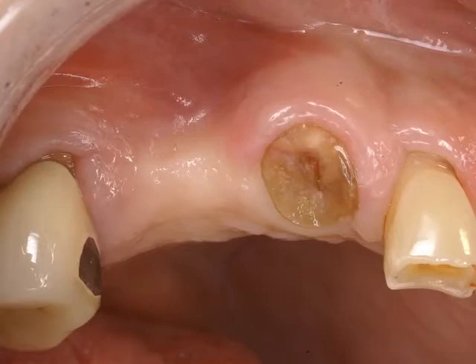Today I'm going to be taking you through optical and 3D scanning to treatment plan missing teeth in the posterior right maxilla. You can see on this patient that decay underneath the canine has forced the loss of this segmental bridge. And what we will go ahead and proceed with is to section the bridge mesial to the first molar and to section the bridge off of the decayed canine abutment.